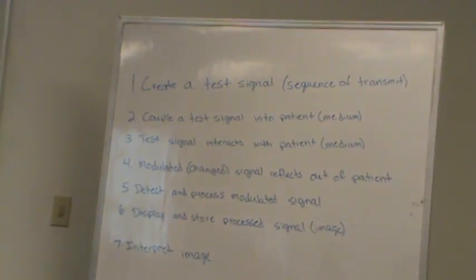Okay, so all of this to say, we've created a test signal. We've done all of the stuff that kind of affects it. We've coupled it into the body. We've talked about the transducer itself now.